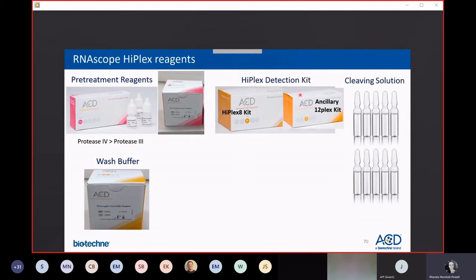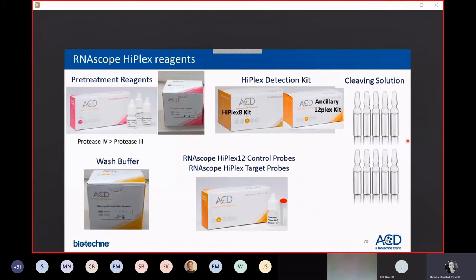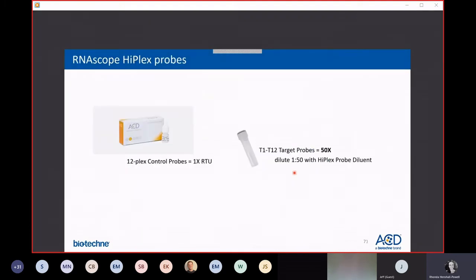If you're looking for 12 targets, you'll then also want the ancillary kit that allows you to detect 12 targets. And it comes with more cleaving solution because you'll do another round of cleaving than you would with an 8-plex. And then the probes. The 12-plex control probes come pre-cocktailed, pre-mixed at 1x concentrate, ready to go. Your target probes will all come at 50x concentrate in little Eppendorf tubes just like this, and you'll use the HiPlex probe diluent.